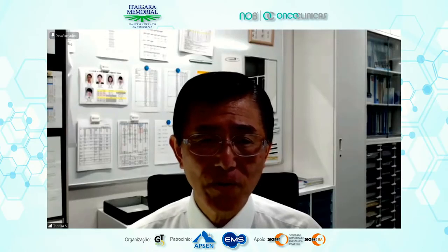I recommend at first, please use the NICE classification. NICE classification, maybe as you know, can detect non-neoplasia and deep invasive carcinoma. After mastering the NICE classification, please use the JNet classification. JNet classification needs magnification. Without magnification, you cannot distinguish between type 2A and type 2B. JNet classification should be spread all over the world, I believe.